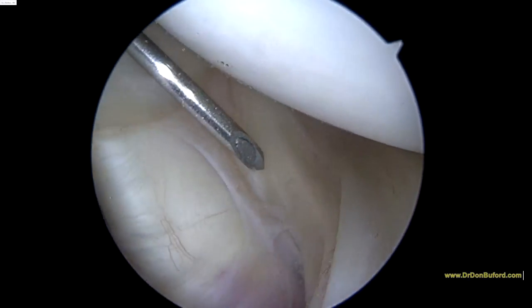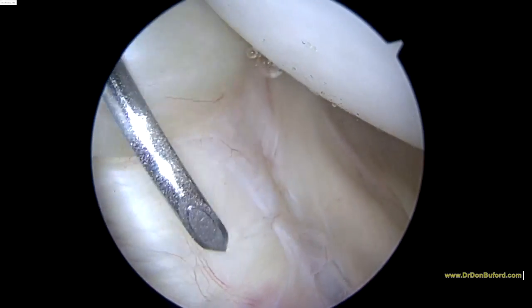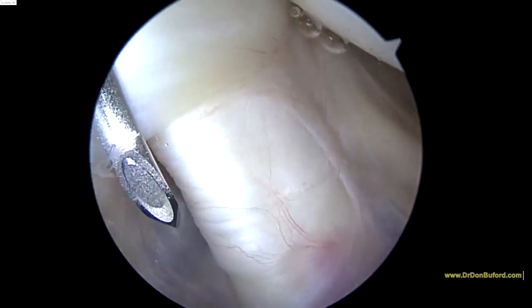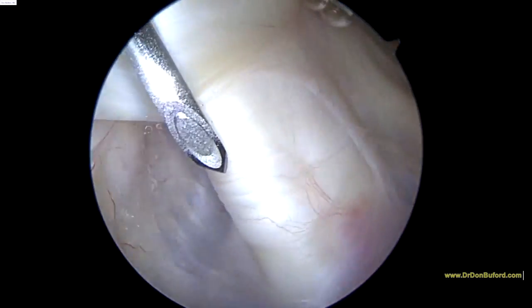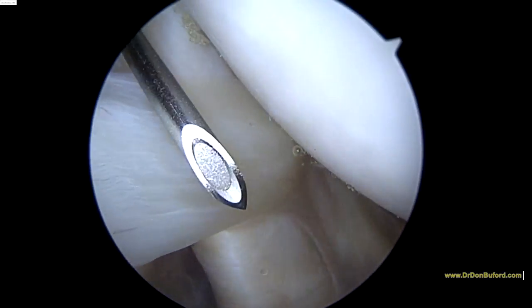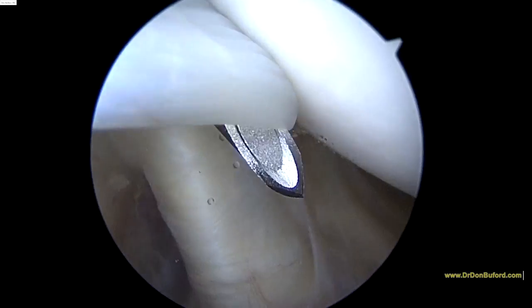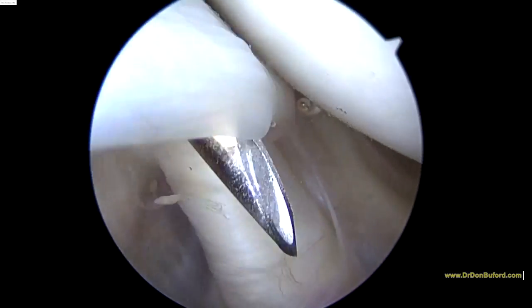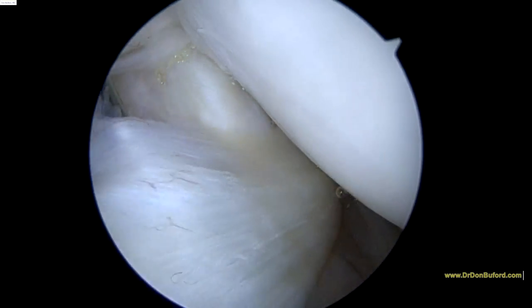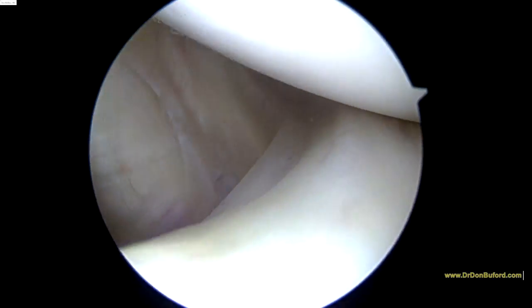Arthroscopically, you can only see about the superior one-third or maybe at most one-half. But this is all subscapularis tendon here. You can see the edge there. And here's the middle glenohumeral ligament crossing the subscapularis right there — so there's a pretty good depiction of the middle glenohumeral ligament.